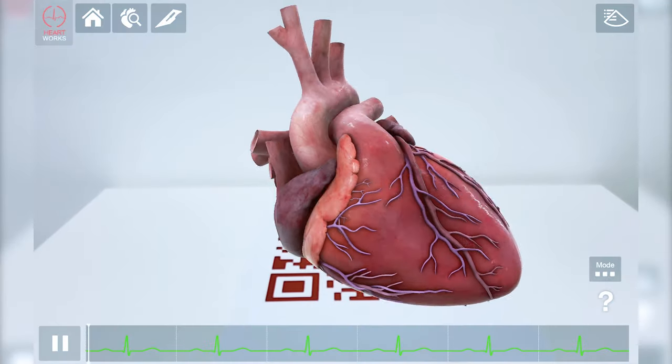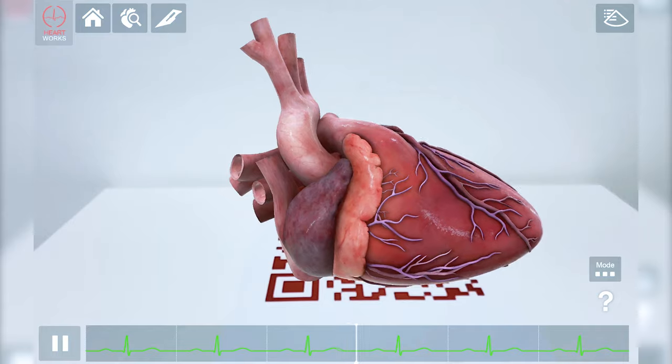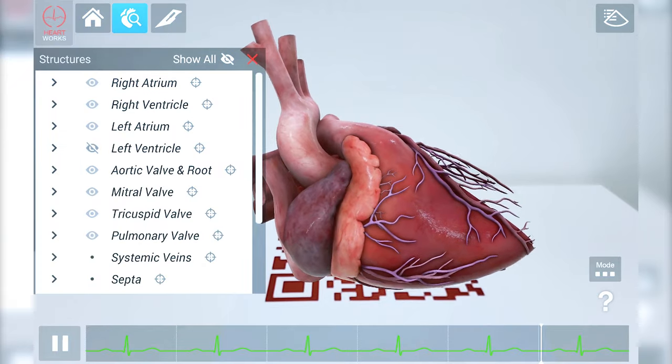While holding the tablet, the heart can be projected onto a flat surface, allowing you to interact with the model and explore the interior.